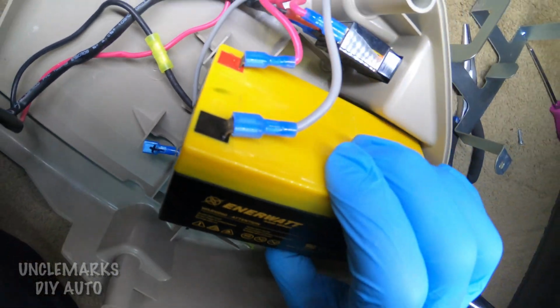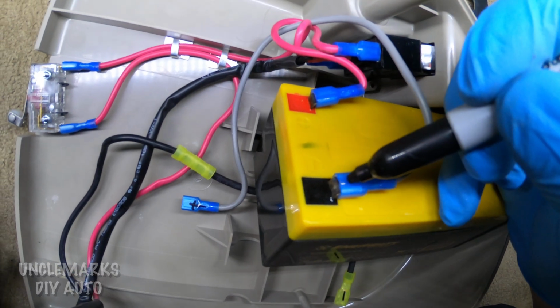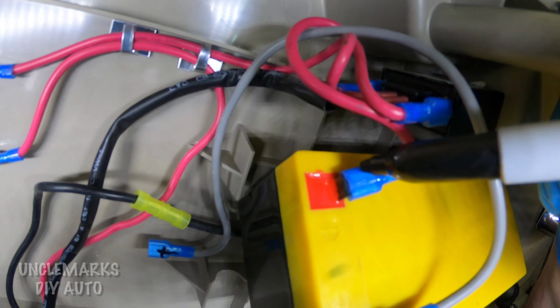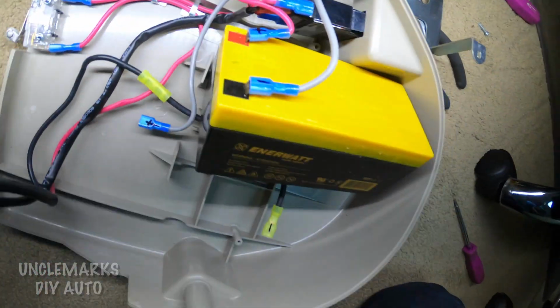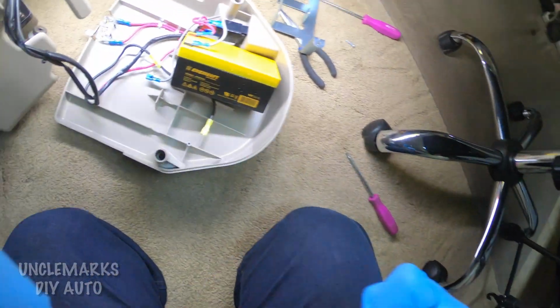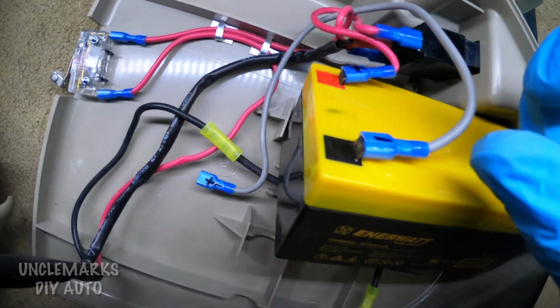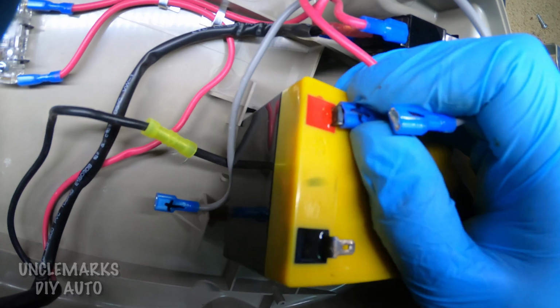And we'll do the same with this one. So we can get it off of there. Make that one the negative. This one, well, red is usually positive, but we saw on the other one it was gray, so good. So take that off, get your new batteries in, I guess. Well, that's basically what the batteries usually look like.